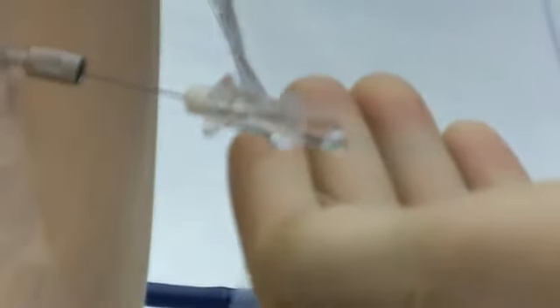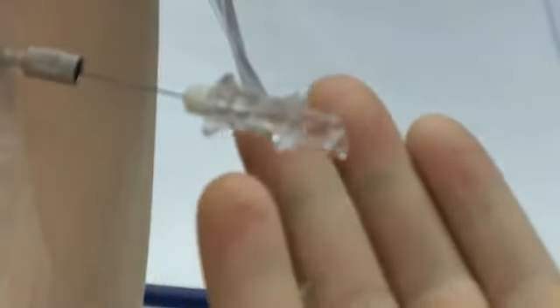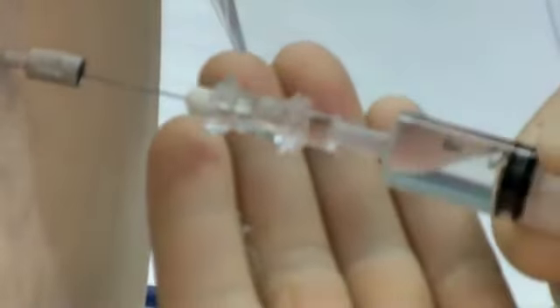So we're confirming our CSF flow. As you can see, the drop of fluid. I'm going to hold the needle at the hub. Make sure there's a secure connection between my syringe with bupivacaine and morphine. I'm going to withdraw, and you see a positive swirl of CSF. Inject the medicine slowly.